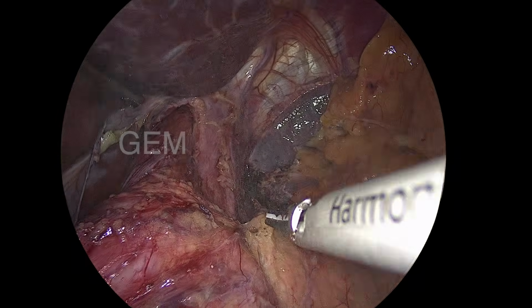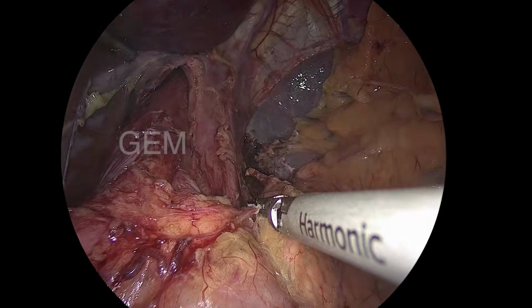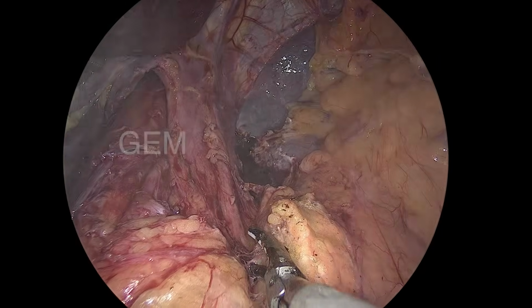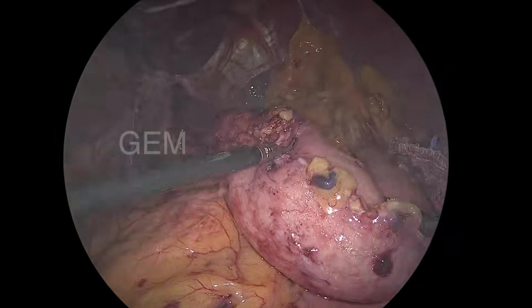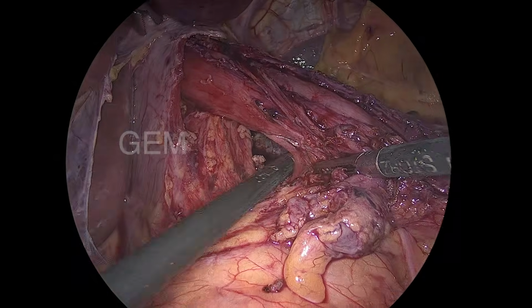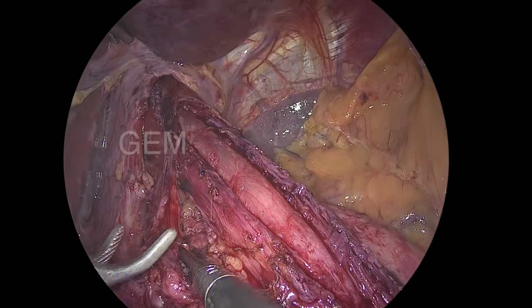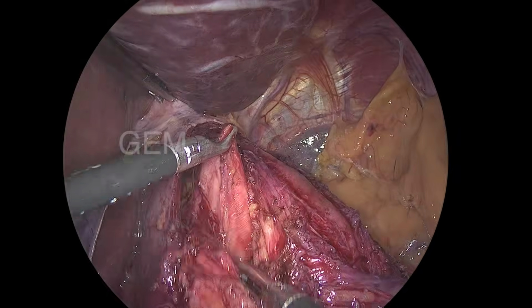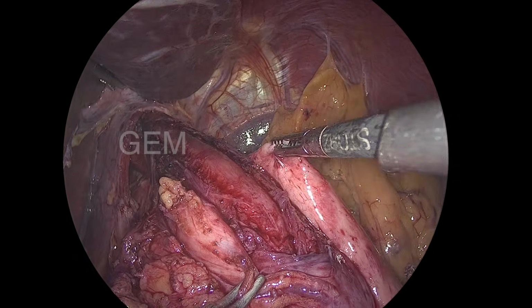You have to be careful about the splenic artery when you are doing this step, because it runs along the superior border of the pancreas. Now you can see how relaxed it is. For a fundoplication, we used to keep a cotton tape on the OG junction and retract the esophagus, but here we do not do that. Only with a tortuous esophagus, sometimes I use a cotton tape.